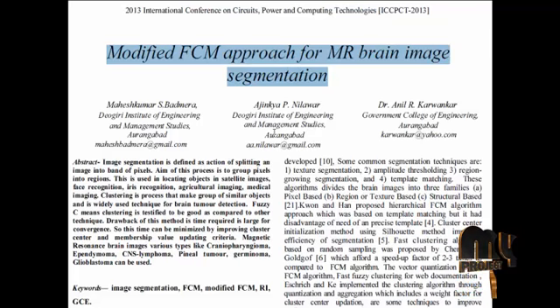Clustering can also be thought of as a form of data compression, where a large number of samples are converted into a small number of representative prototypes of clusters. Image segmentation in a high dimensional feature space is more time intensive than in one dimensional feature spaces. The modified FCM algorithm is based on the concept of data compression, where the dimensionality of the input is highly reduced. The data compression includes two steps: quantization and aggregation.